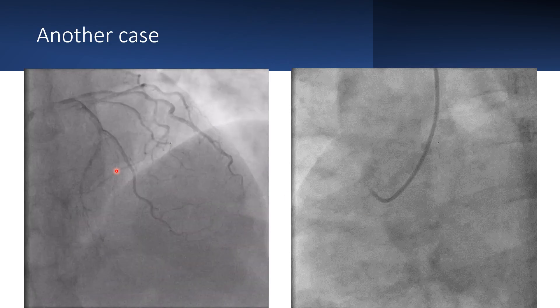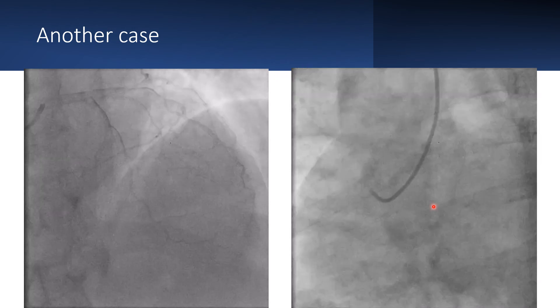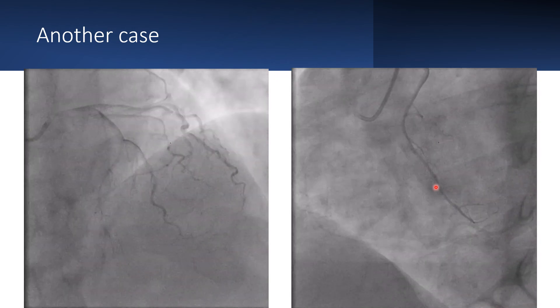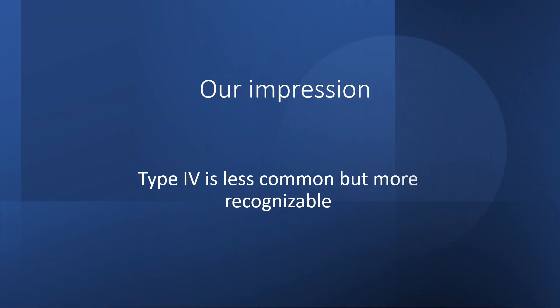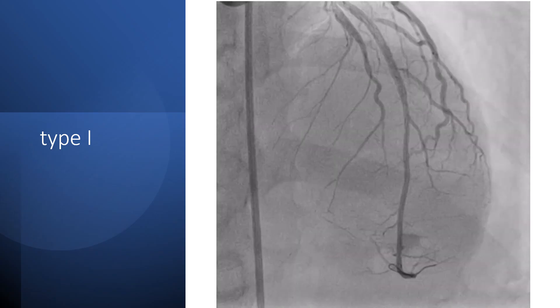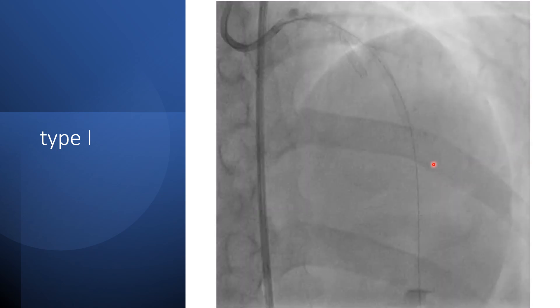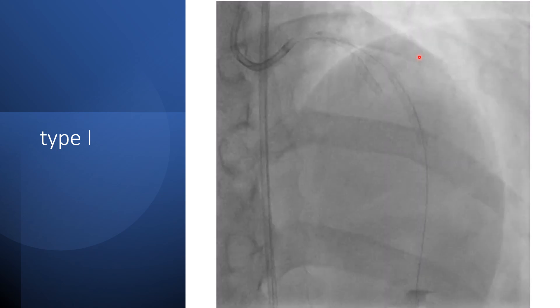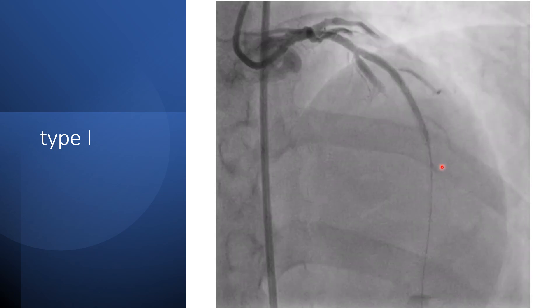This is another case: this is the short LAD, and the long LAD is arising from the RCA and then running into the interventricular groove. Our impression is that type four is less common but more recognizable. This is a type one dual LAD, where the long LAD runs from left to right across the left interventricular groove, while the short LAD runs in the normal course.